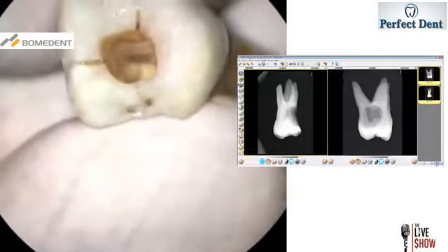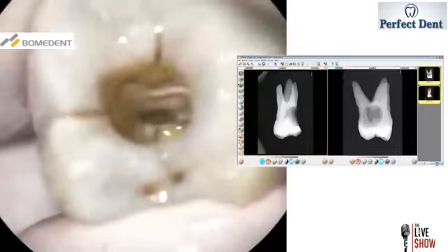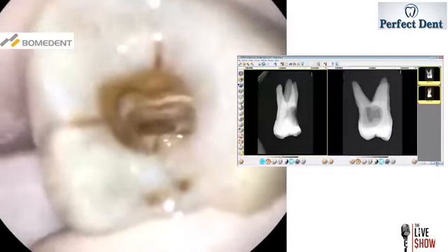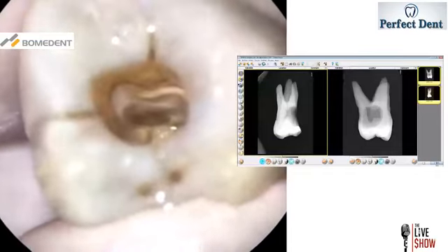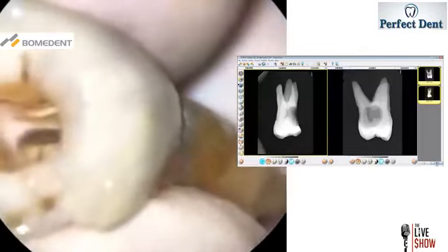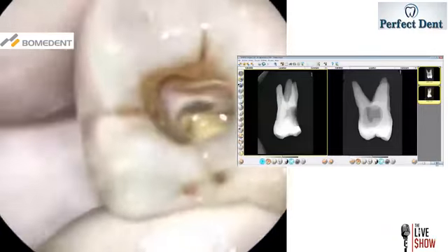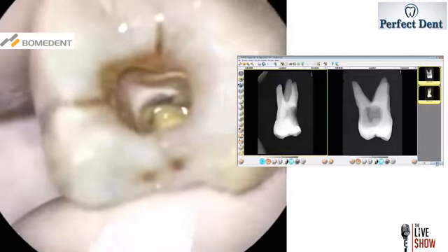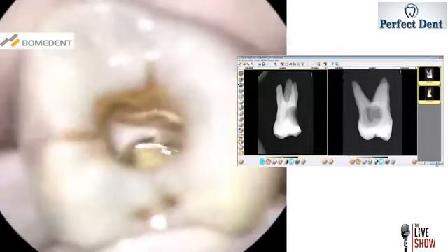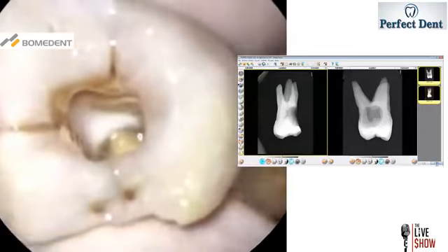Okay, and if you look very closely, you can see bubbling. Can you see the bubbling? Yeah, let me take a look. It's not clear. Well, you can see there's white residue. That's the residue of the bubbling. Those are bubbles, but it's not very clear. The resolution is not very clear on the screen.